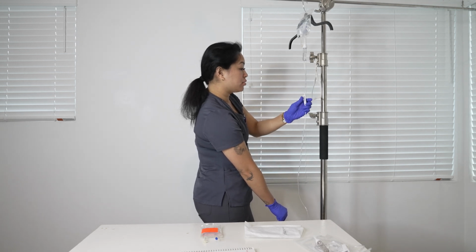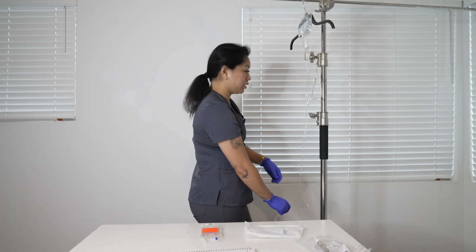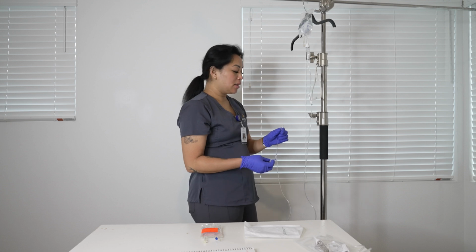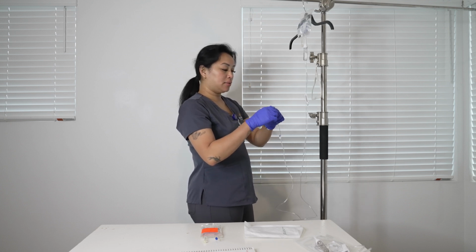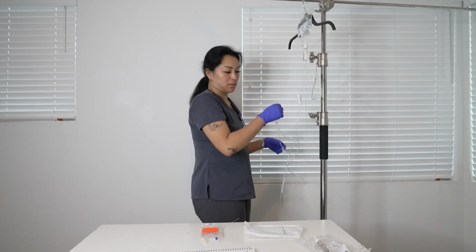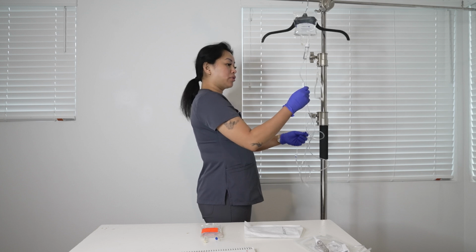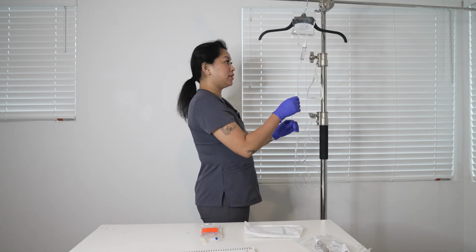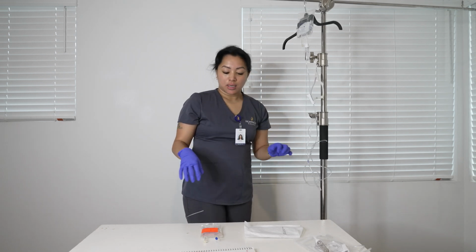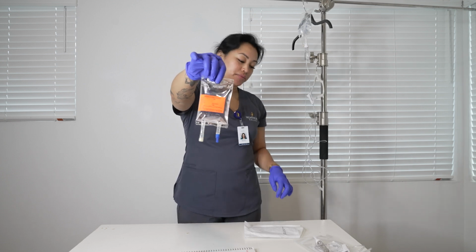Alrighty. So now that I have regulated the drops per minute, which is 38 drops per minute for the fluids, I will now cap this back on, and that has been primed and it has the 38 drops per minute. And the roller clamp is all the way down to prevent it from leaking through. So now that that is good, now we have our amoxicillin, the medication.